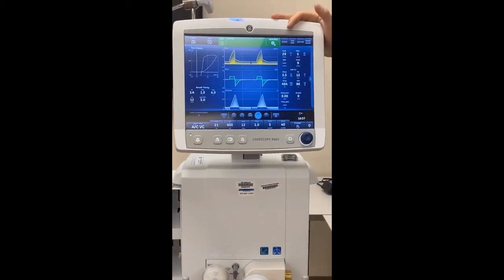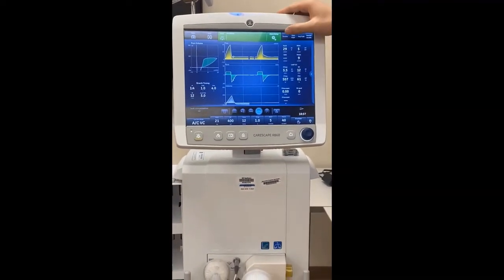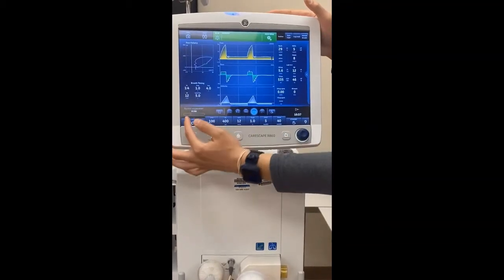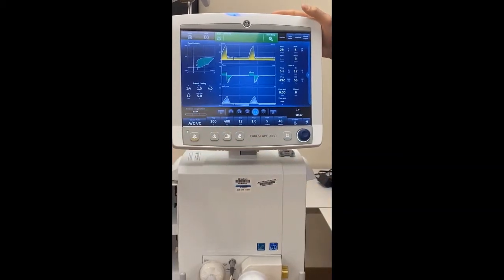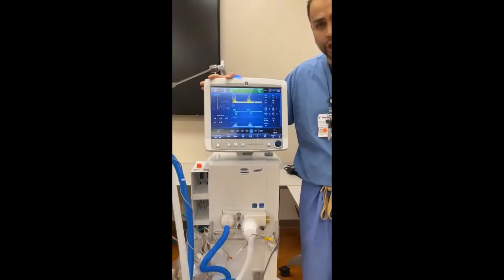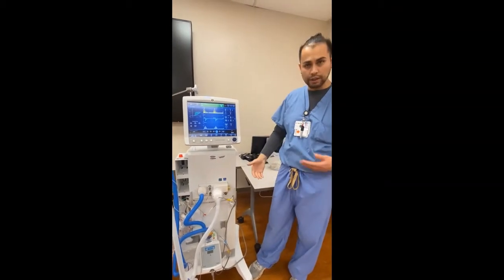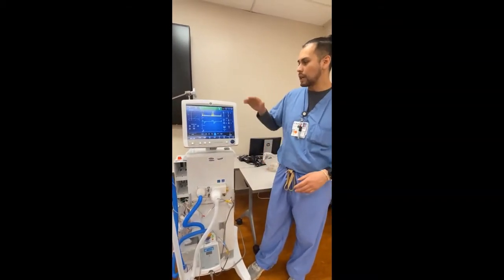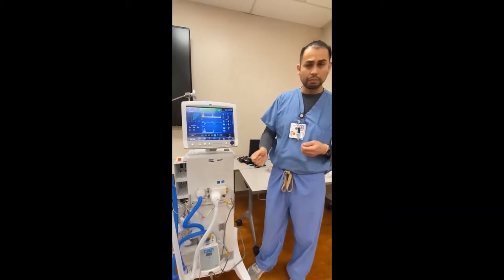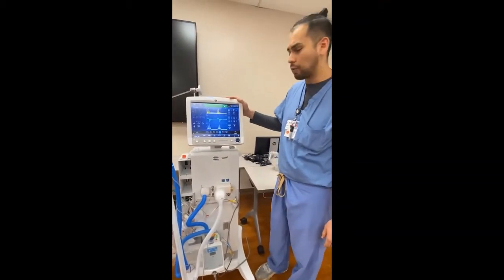We also have another suction button on the top right-hand corner over here, which says suction. If we press this suction button, it will do the same thing. It will give us 100% oxygen, but that bar will be divided into 3 pieces. Each piece is 2 minutes of oxygenation, giving a total of 6 minutes of pure 100% oxygenation. At this rate, we can do it for suctioning, but also if we need to turn the patient and bathe them. It's very important that we have them hyperoxygenated if they're at risk of desatting with movement or changing positions. This will give us just a little bit more time to have them oxygenated while we're doing those tasks.